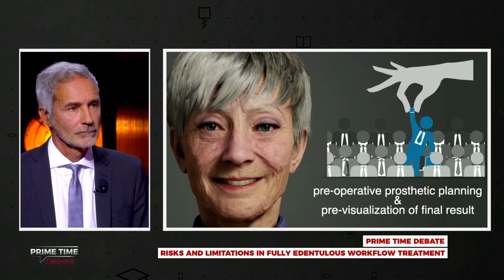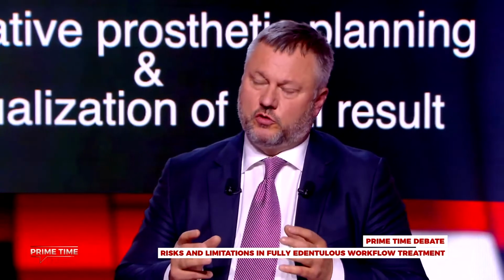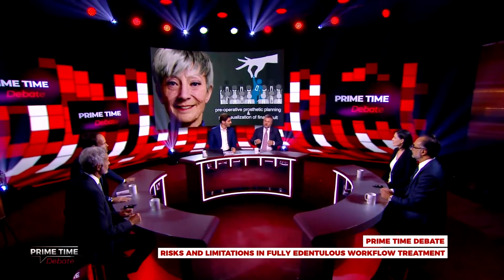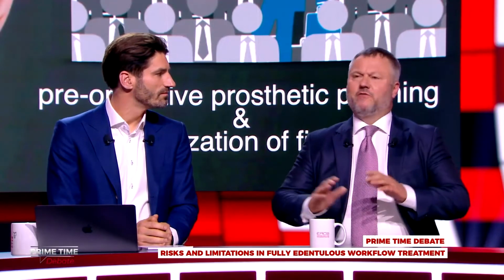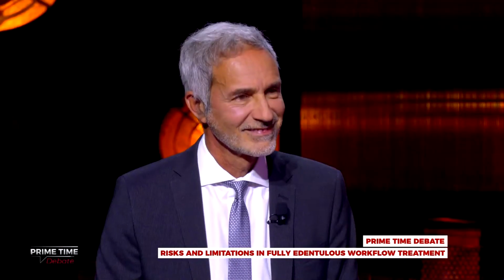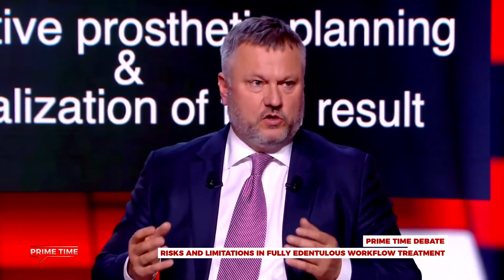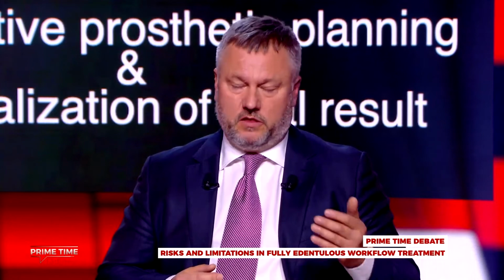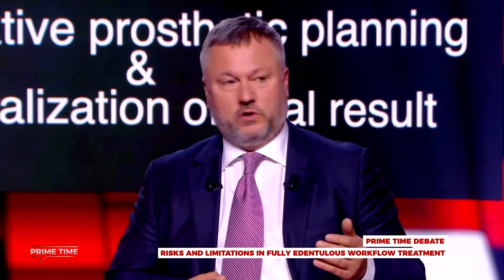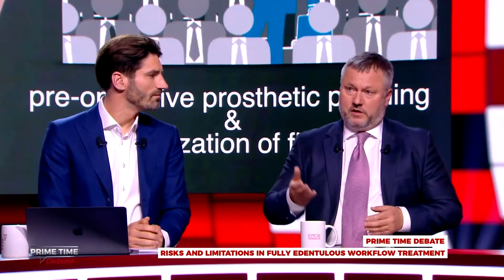I think here we really have the first conclusion of the evening, because some of our colleagues, I remember I went to a course on guided surgery 13, 14 years ago, and the guy that was giving the course said, no, here we never do overdentures, we do fixed for every patient. And I think the first conclusion is really that you have to evaluate the patient, and you cannot give every patient what they wish for, which is fixed. Because like you said, you're looking at the profile of the patient. Of course.